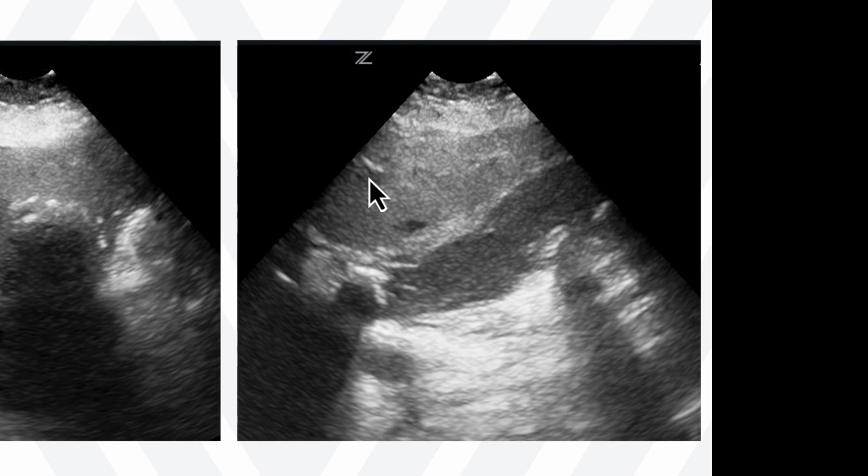And in this example here, we see the left lobe of the liver. We see the gallbladder, but you see how the fluid is not really the normal pure looking black that we would typically see. It's a little more gray, has a little bit of different echogenicity within it. So this is a gallbladder that's filled with sludge. This is all gray sludge.